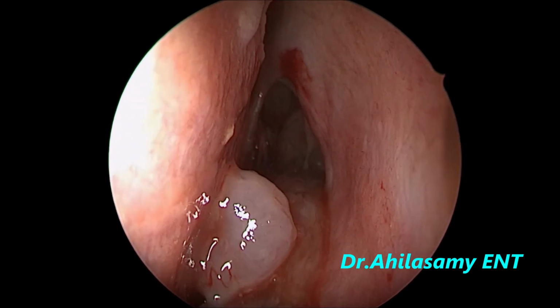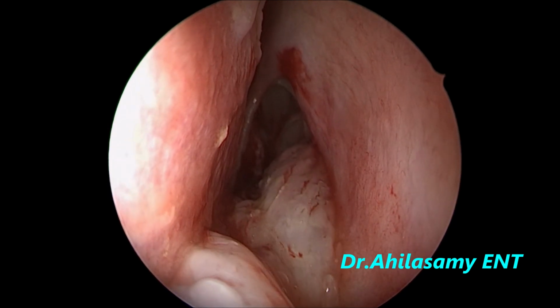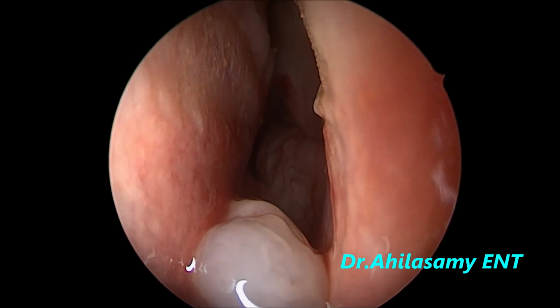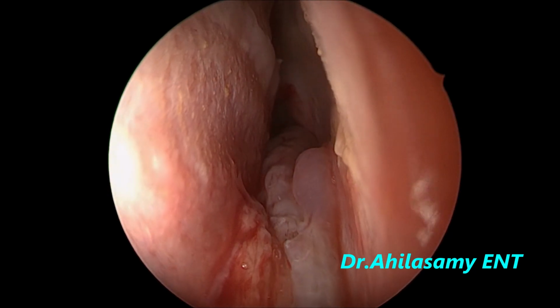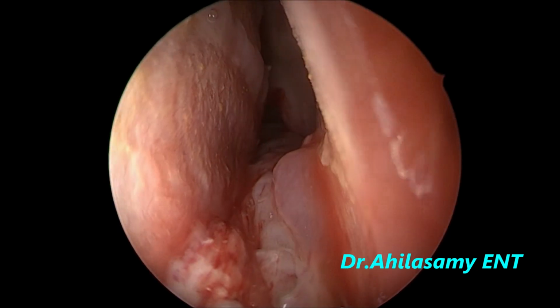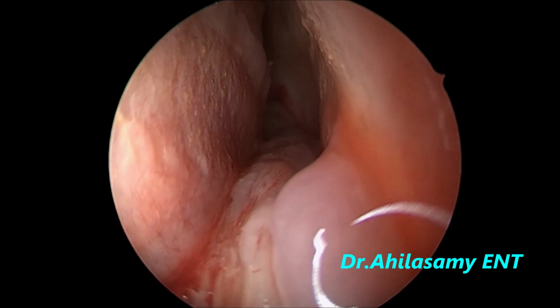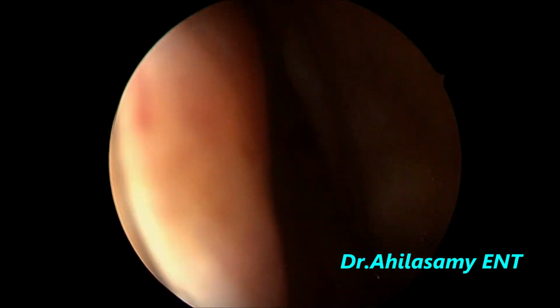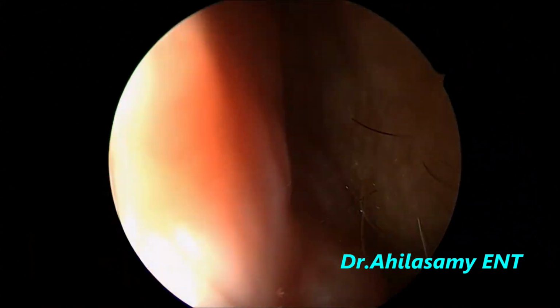There was a lot of mucus collection within the maxillary sinus. Gently pulling it out with the Blakesley forceps. Remember, it is a 79-year-old male patient. Surgery being done under local anesthesia with moderate IV sedation with dexmedetomidine and fentanyl.